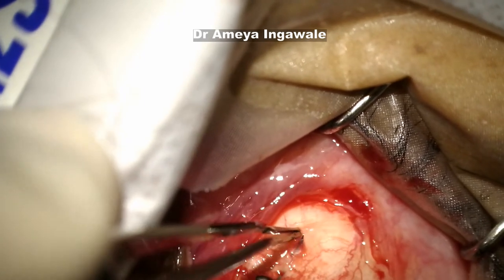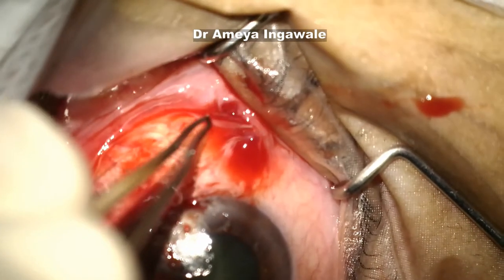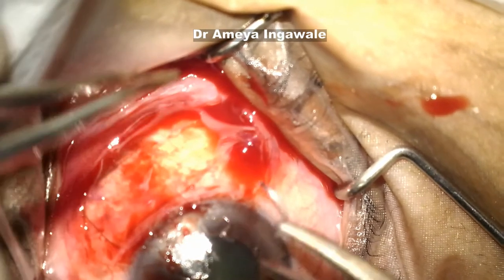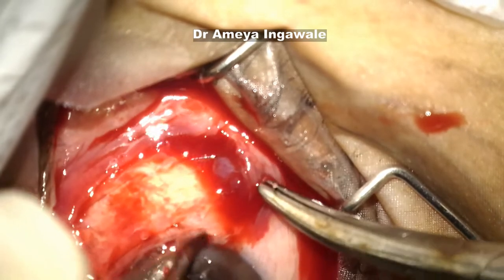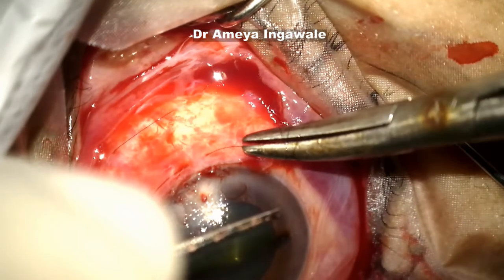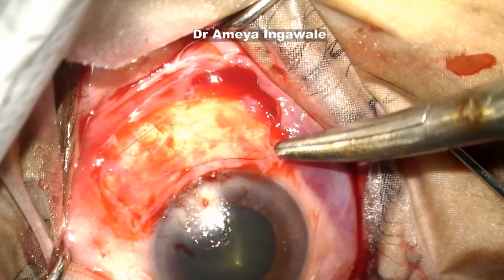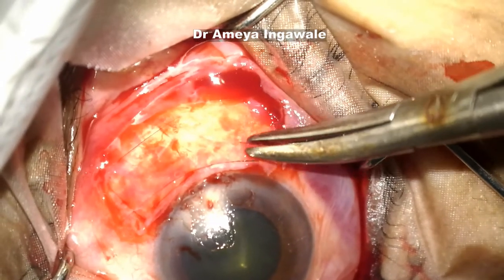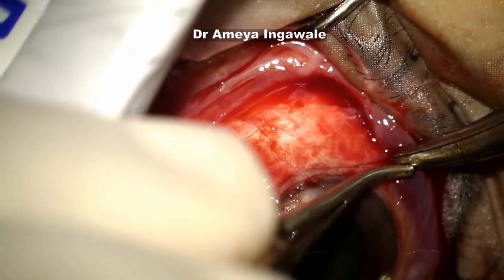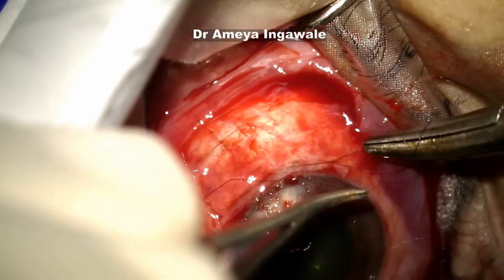Glue is of course a better alternative, but a little more expensive. This method, although time consuming compared to glue, is quite common. Here I got a bleed unfortunately when I was taking the suture bite, so I just waited until the bleeding stopped and continued. This method gives a very good cosmetic appearance — you can cut the suture next to the knot about 15 to 20 days from surgery and gently release the suture from between the bites to remove the entire suture in one shot.